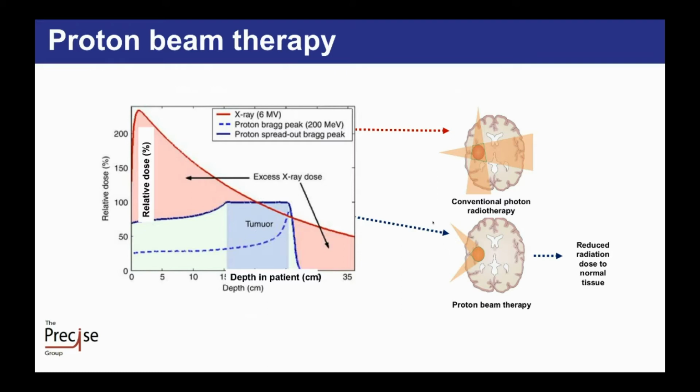Now, obviously, for a tumour, we can't just deliver a single Bragg peak, and so we deliver a range of energies. But if we look at what happens with proton therapy, you can see here there is a sharp fall off at the distal edge, and there's no dose beyond effectively where the tumour is. And you can see, again, we're delivering at multiple angles, but here a small amount of dose goes into the healthy tissue in front of the tumour, but beyond the tumour, we don't deliver any dose.